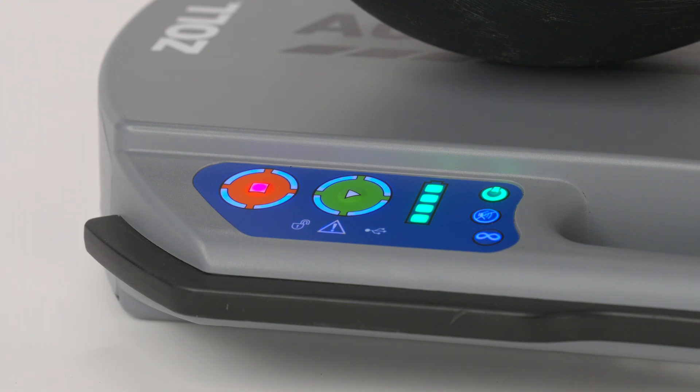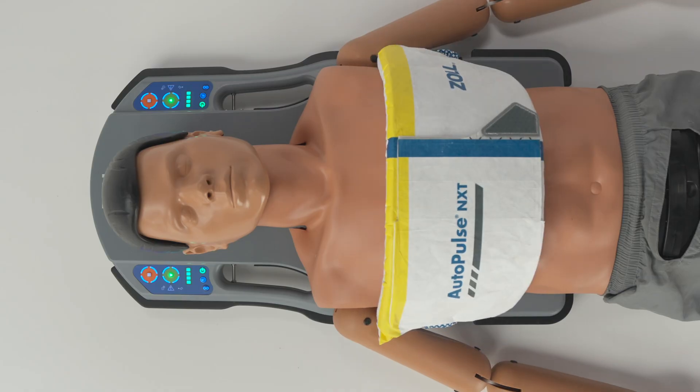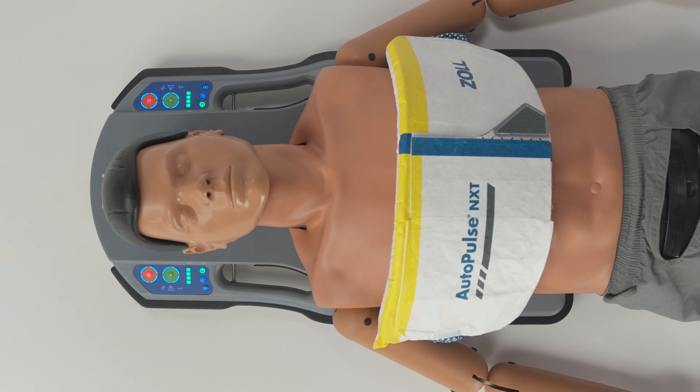To start compressions, press the green start button. To pause compressions, press the orange stop button once. When paused, the device will beep every 10 seconds to notify the provider that compressions have stopped.